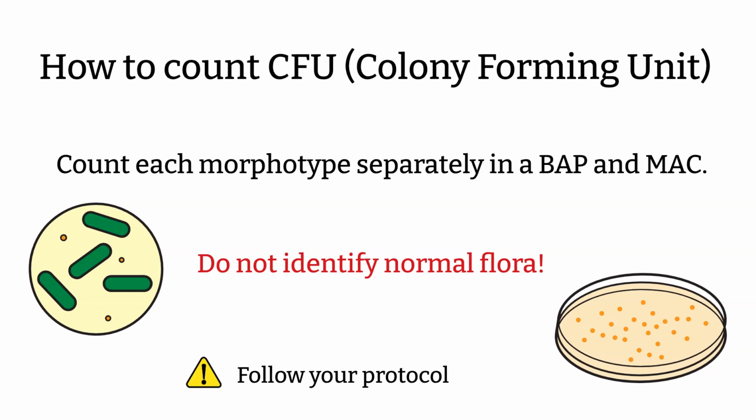Do not identify normal flora. This is a big pitfall for new CLSs. A lot of new people would try to identify everything, but that's not necessary. There are organisms that are considered normal flora and don't cause any harm, so we do not need to identify and perform a sensitivity test on those.